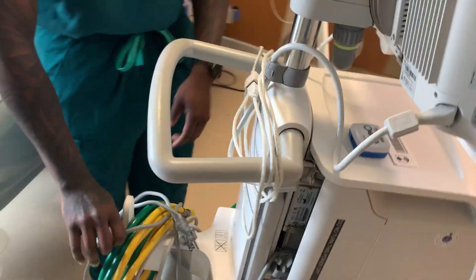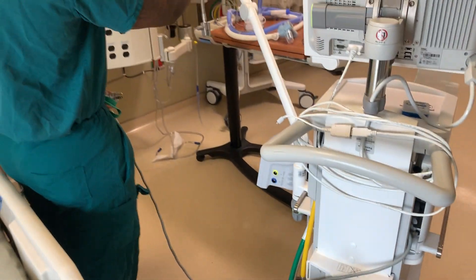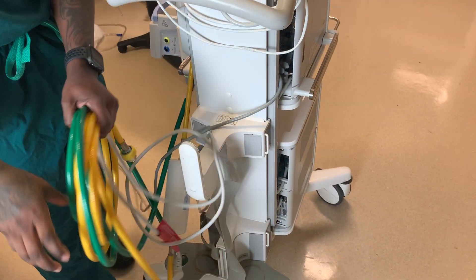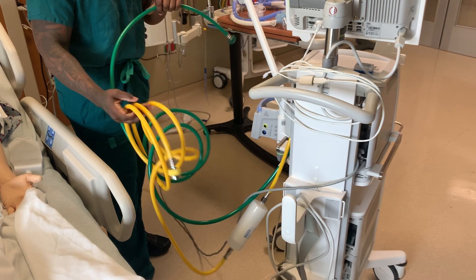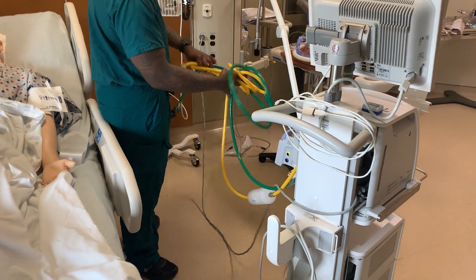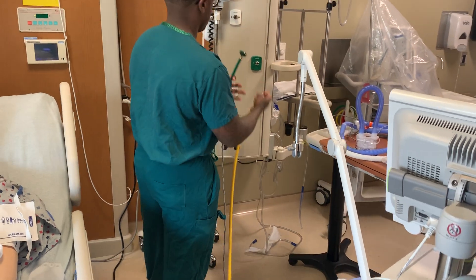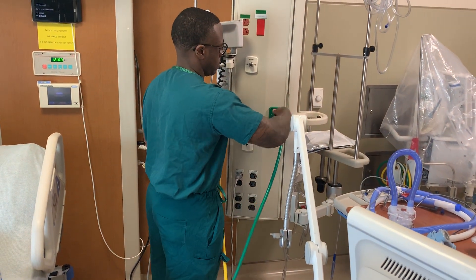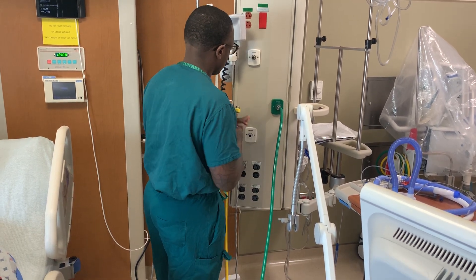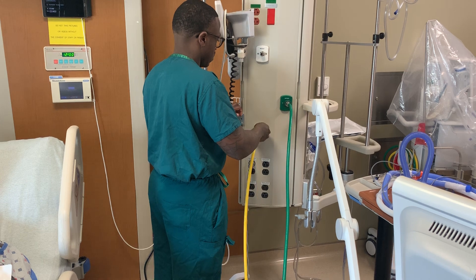Behind the ventilator, we have our power cord. I'm going to plug my power cord up. We also have two 50 PSI air and oxygen hoses. I'll plug those in as well.